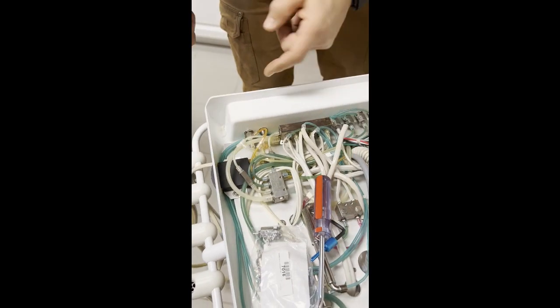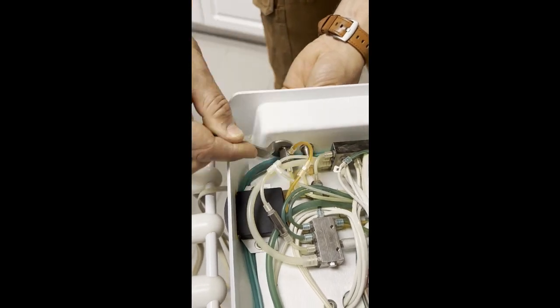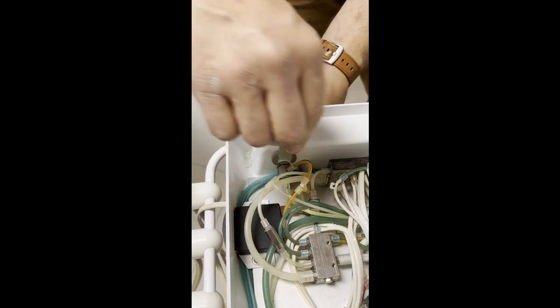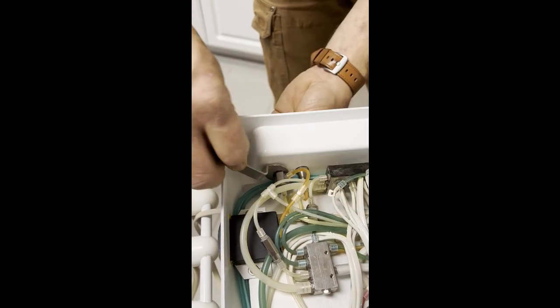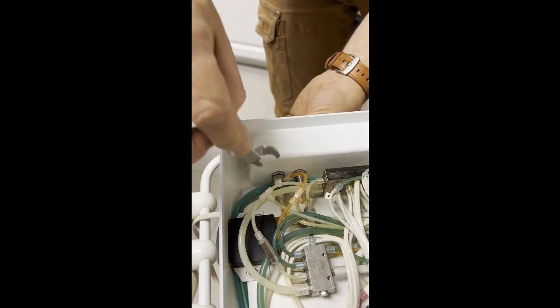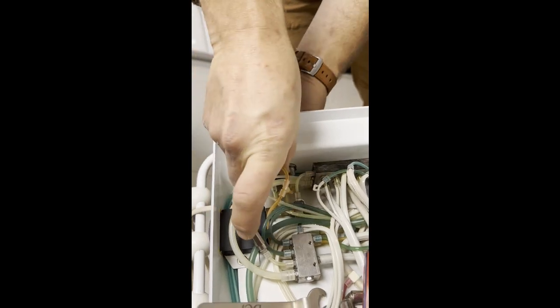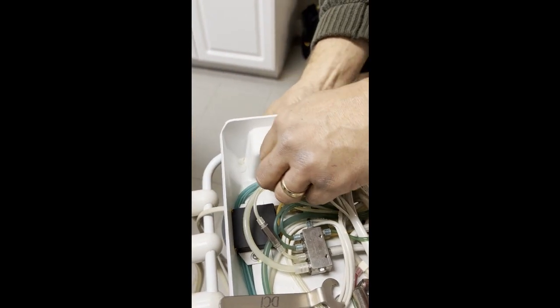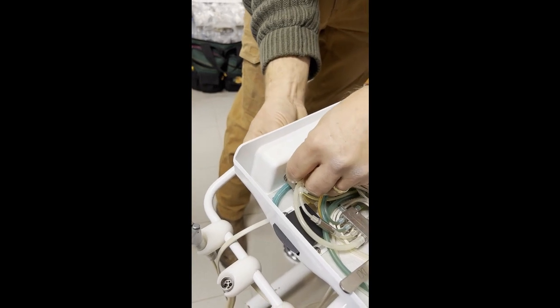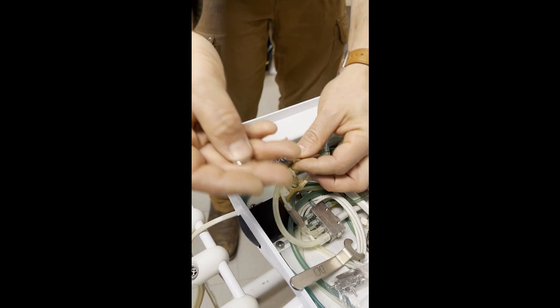To remove the leaky valve, we're going to turn the nut backwards using the panel wrench. This is specifically designed so that it will fit inside the delivery unit head, and you can get in there and loosen it. So then I'm going to turn the outside nut, and then we're going to release the unit.